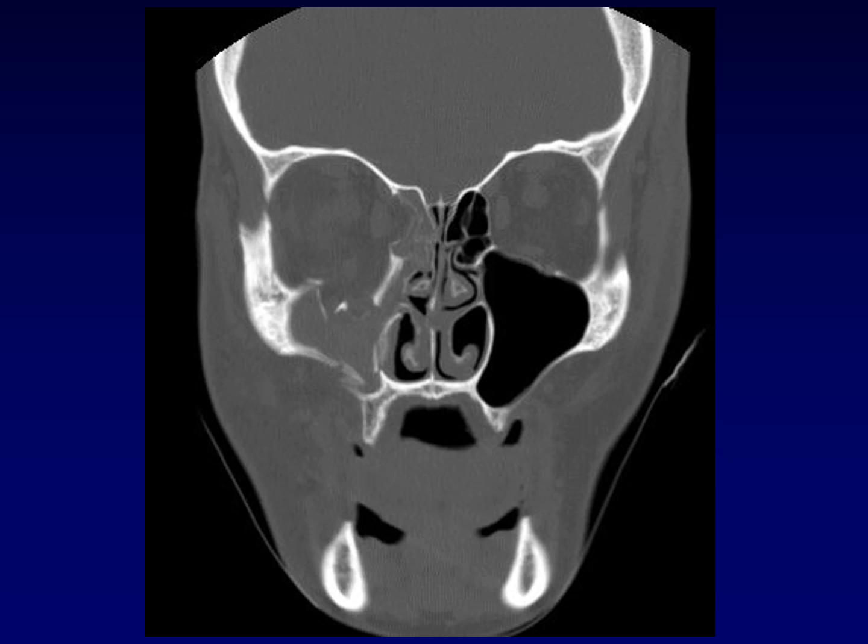Here's an example of blowout fractures in the right orbit. You can see that the normal contour of the orbital floor — which, judging from the other side, should be about here — has all fracture fragments displaced inferiorly, with orbital fat herniating through into the maxillary sinus. Interestingly, large fractures like this rarely result in entrapment; it is the smaller fractures that can entrap the extraocular muscles. Notice that the inferior rectus muscle has accompanied the herniated fat and is herniated in its own right.